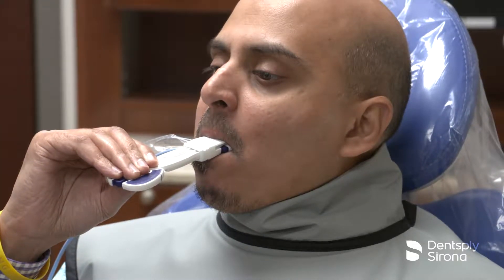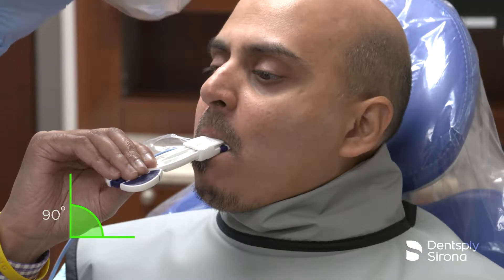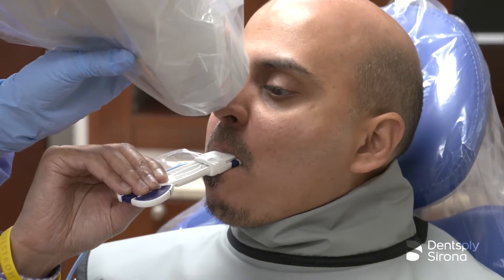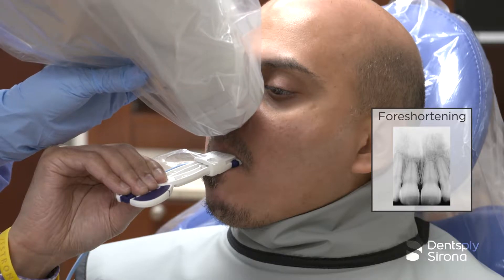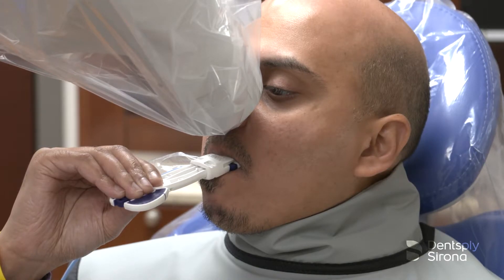The vertical angle, however, must be directed at 90 degrees to the imaginary bisecting line. Too much vertical angulation will produce images that are too short or foreshortened, and too little vertical angulation will result in images that are too long or elongated. The beam must be centered to prevent cone cutting.